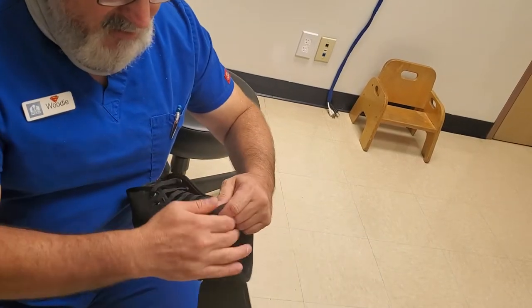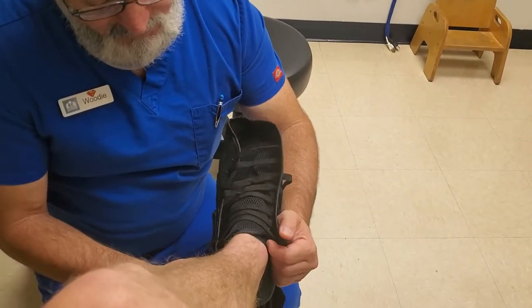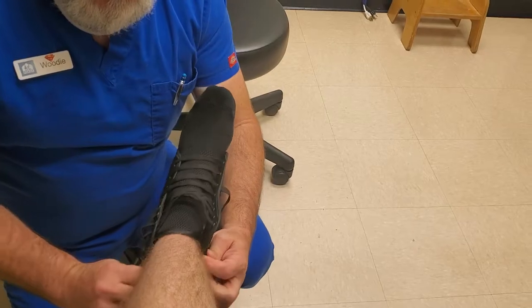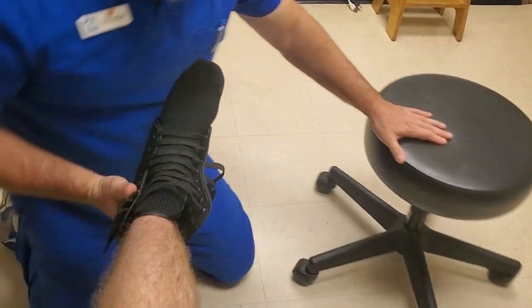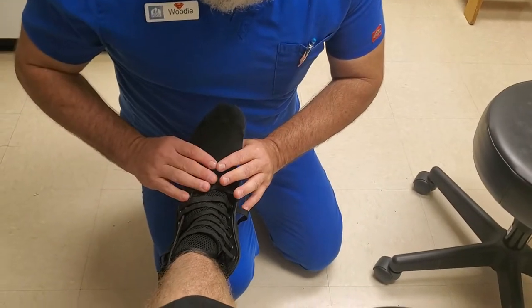They come in different sizes, so make sure you have your patient's shoe size. Have them help you slide it in. If the patient is wearing a sock or a type of hose it'll slide on and off much more easily. I'm going to move this out of the way and switch knees so you get a better view. Have the patient just rest their foot and flex just a little.